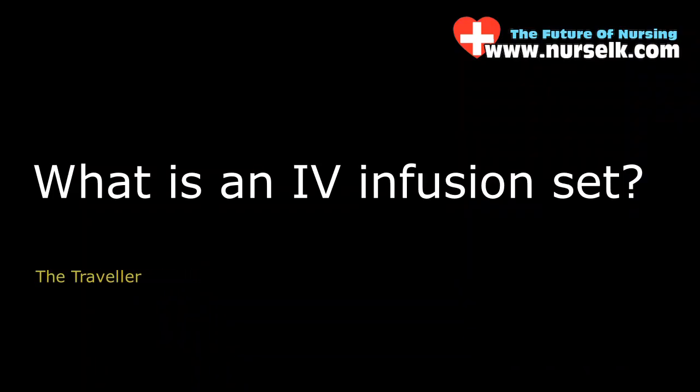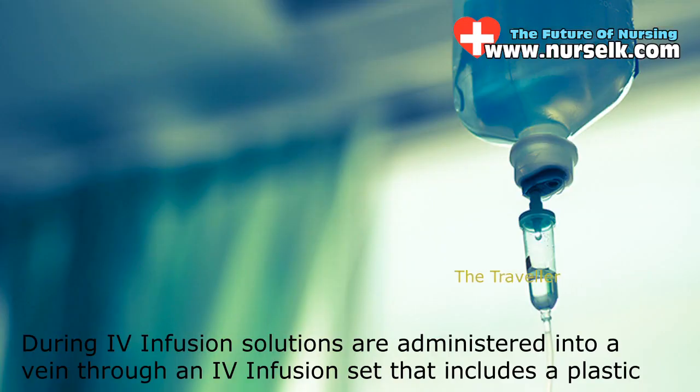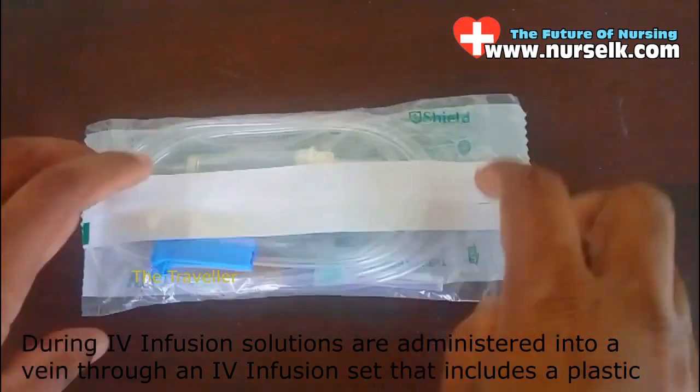What is an IV infusion set? Intravenous infusion is the fastest way to deliver medication or replace fluids throughout the body. During IV infusion, solutions are administered into a vein through an IV infusion set.